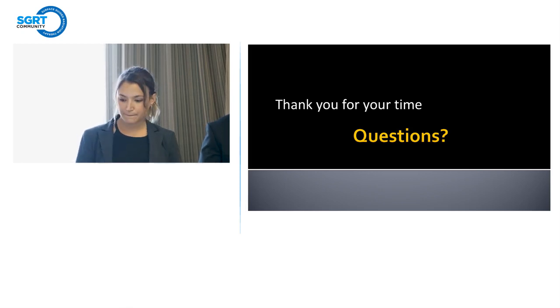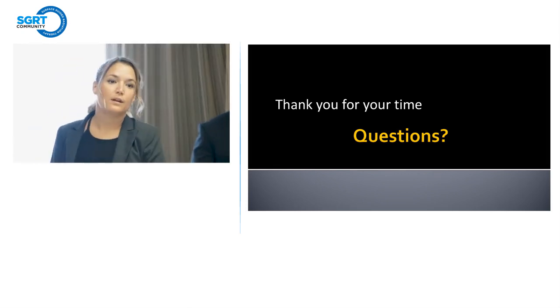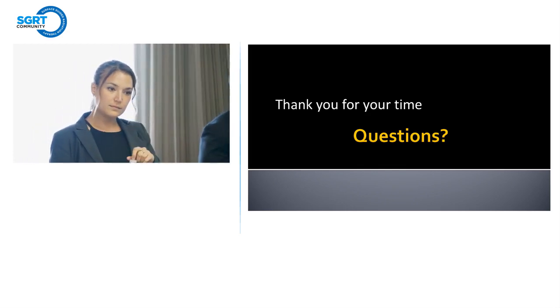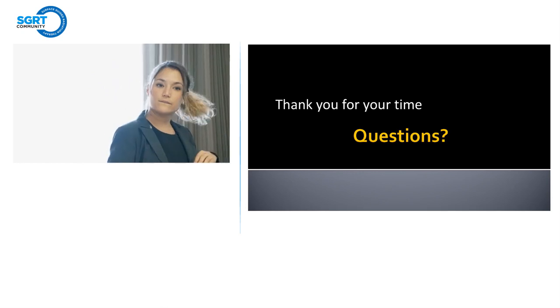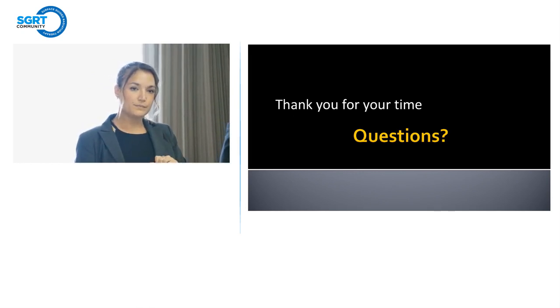So one of the things you said that you guys are looking at doing in the future is eliminating those first 3 steps in your current workflow and moving away. We heard from some people this morning of not having tattoos or not having those marks. So what do you think will help get you guys there? Do you have any hesitations or thoughts on that?